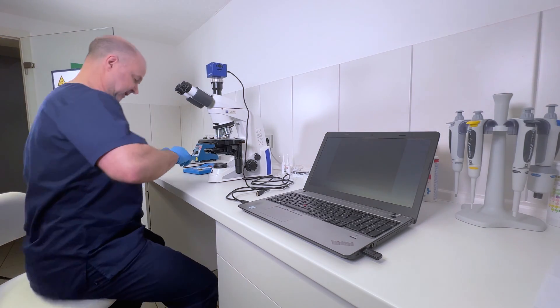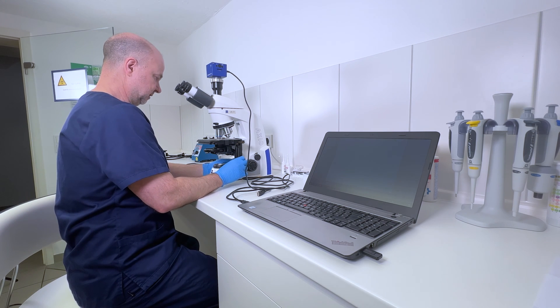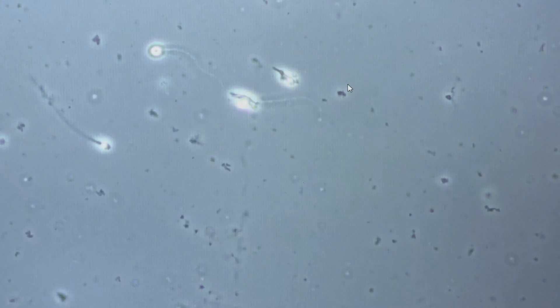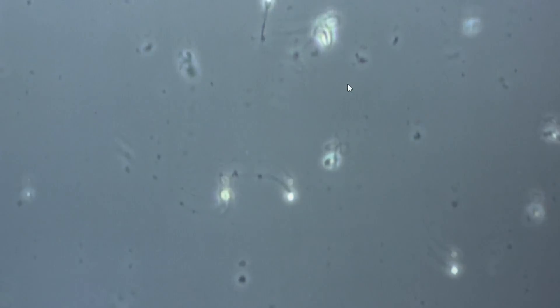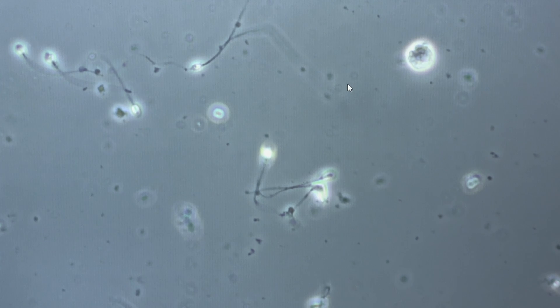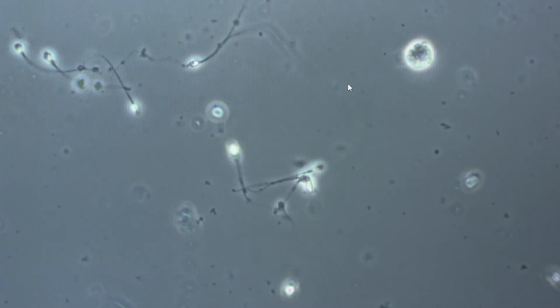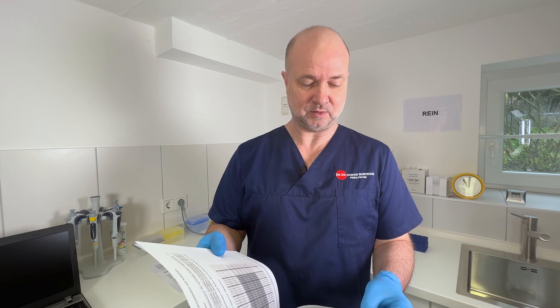Let's have a look at what's inside — I will have to count the sperm. I'm showing you what I see on my computer screen. My task is to look at one of those fields and count the sperm within it. I have a counter, and it's around 10 to 15 sperm per field. Now that I have a first impression of how the sample looks, I go to my smart booklet to look up how much I have to dilute the sample. When there are 15 to 40 sperm per field, I will dilute it one to ten.